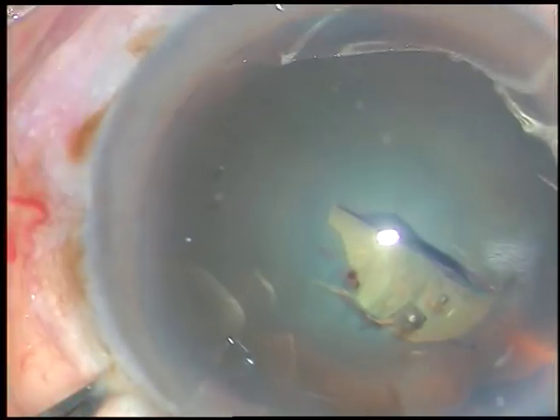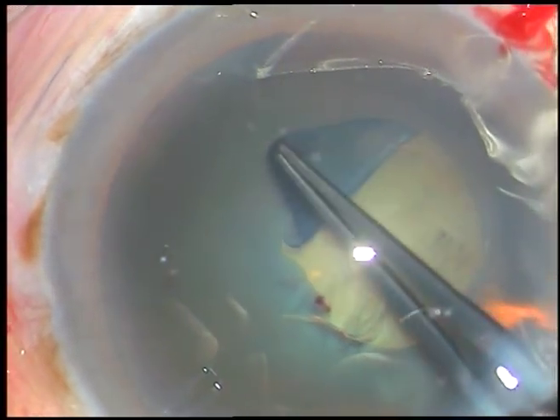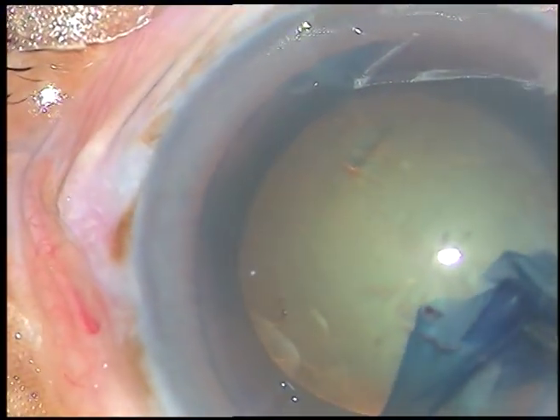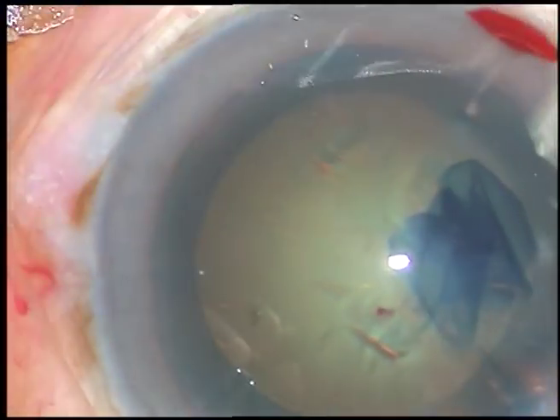This is how I do capsulorhexis. Incise the capsule with a needle. Raise a flap. Hold this flap with a Utrata forceps and keep the flap in a flipped position. The rhexis becomes very good like this.